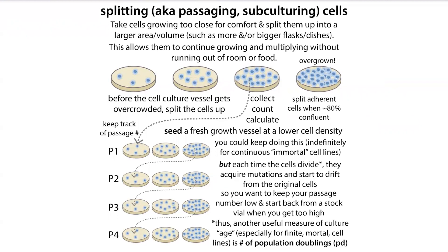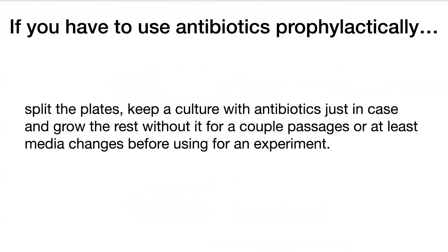When you do this, you can passage so that you have two growths going in parallel — one with the antibiotic and one without. This way, if there's some contamination, you'll be able to see it in the plates without antibiotics but not the plate with antibiotics. That tells you there might be low-level contamination in your antibiotic-containing plates as well. You can also keep those cultures with antibiotics as a safety net if something happens to your plates without antibiotics.